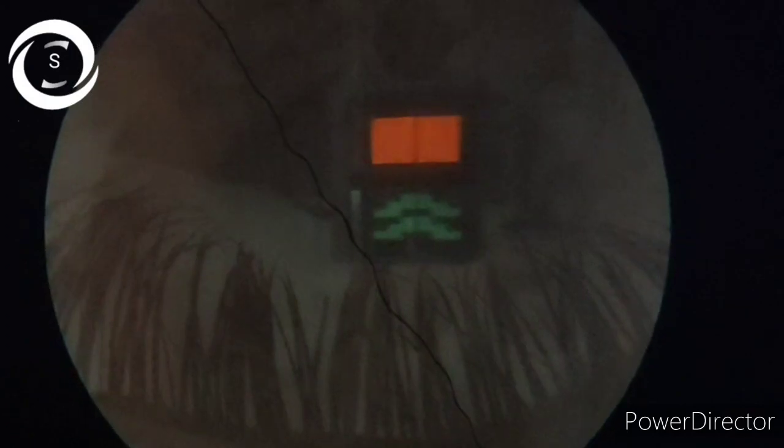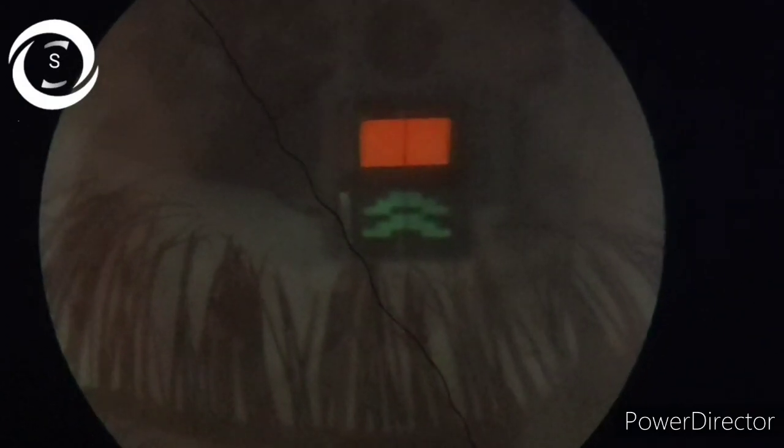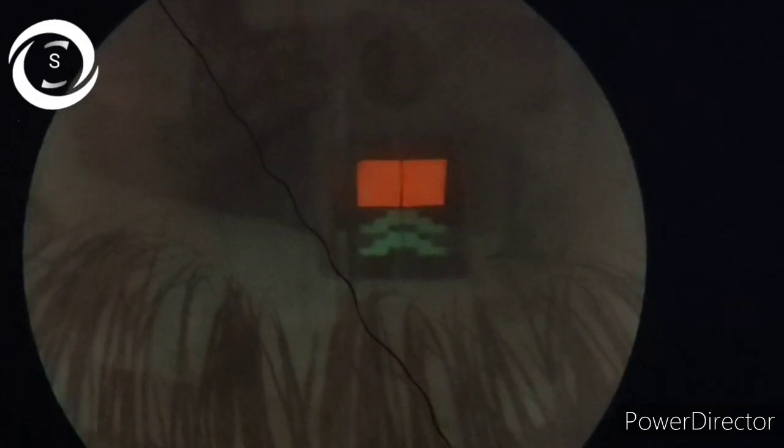And now we will move it in the horizontal direction and you can see that's how you see the image. Again I have increased the gap and at that point the reading will be incorrect. And that's the end point where the red box should just touch the green arrows and here you will take the reading.